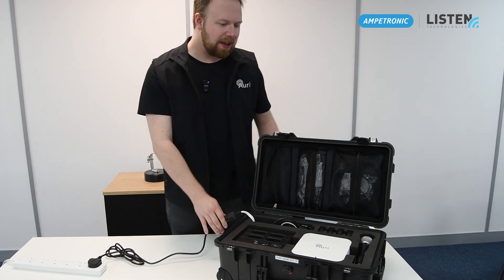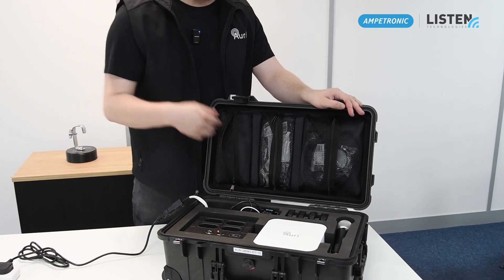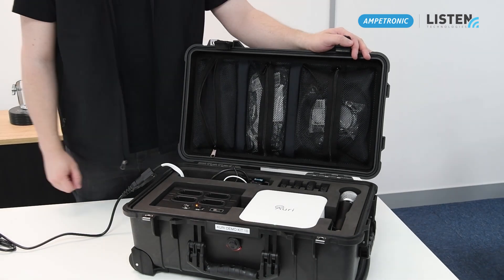You should see the equipment start lighting up. On the media player it should start auto-playing the MP3, and then on the transmitter itself you should see a steady green light.